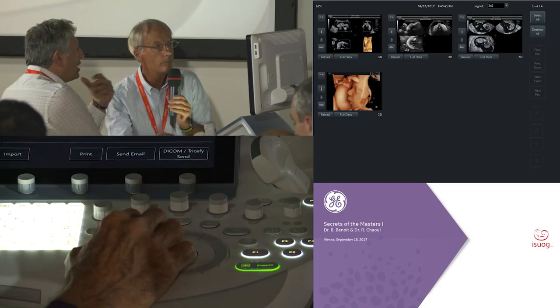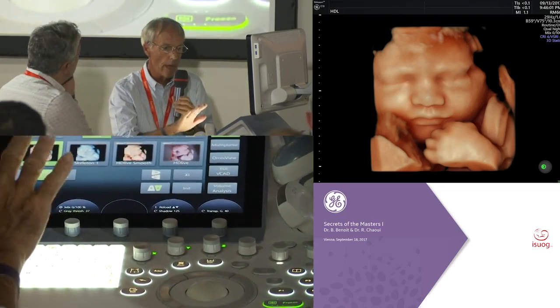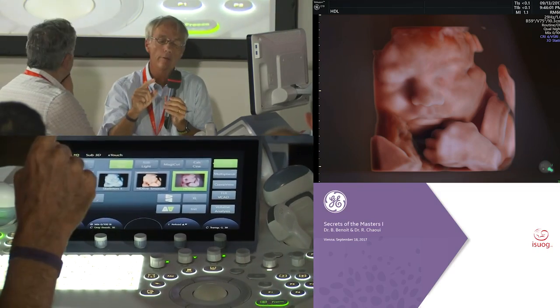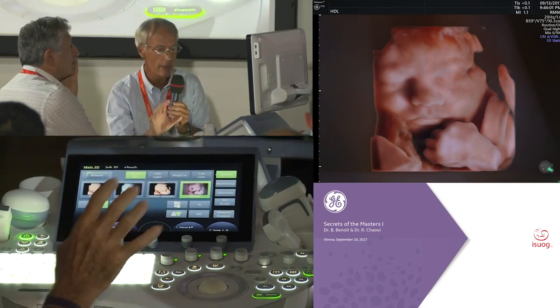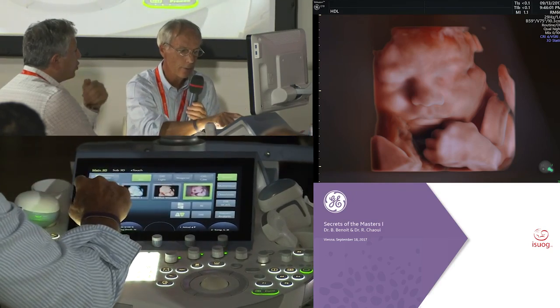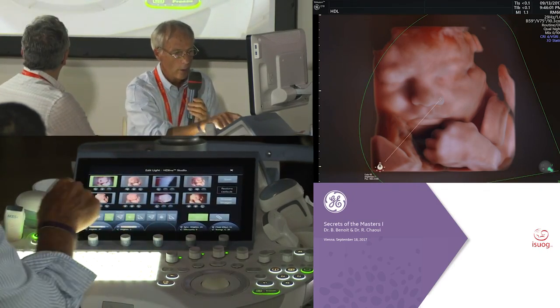But when do you use the other one, Studio and so on? This is HD Live, but there is a new one, the HD Live Studio. It's this one. In this case, it's possible to have 3 light sources, but it's difficult to manage. But what I do, you can go on sub. Here you have different settings.